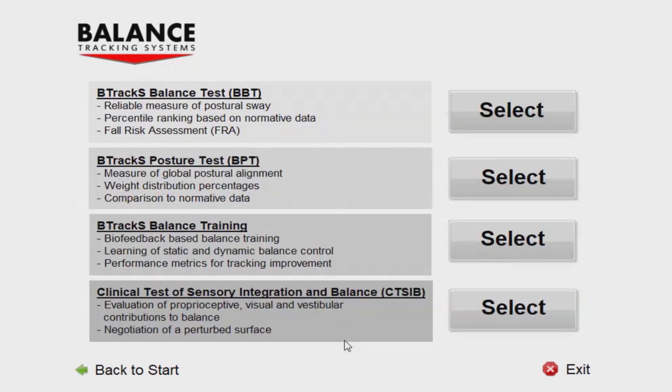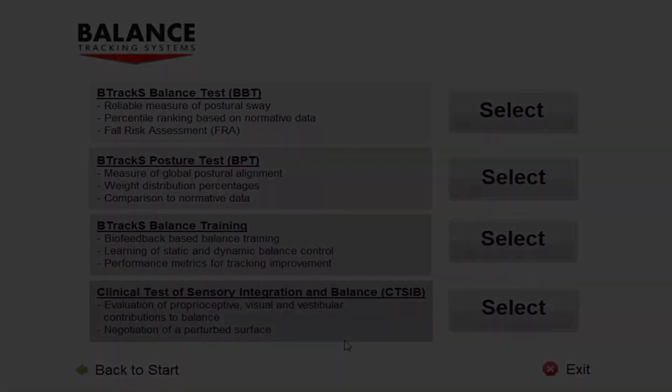At this point, you are now at the Protocol Selection screen. In subsequent videos, you will learn about each of these protocols and how to perform them.